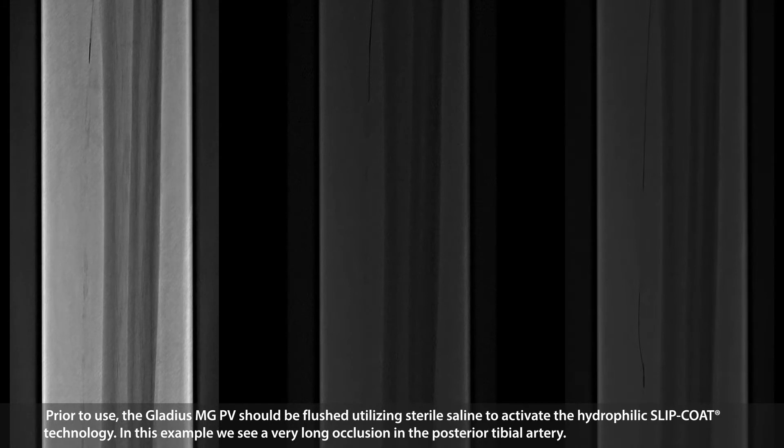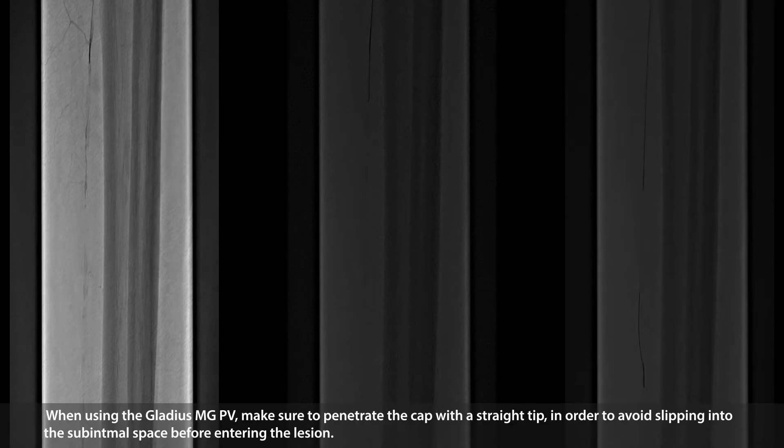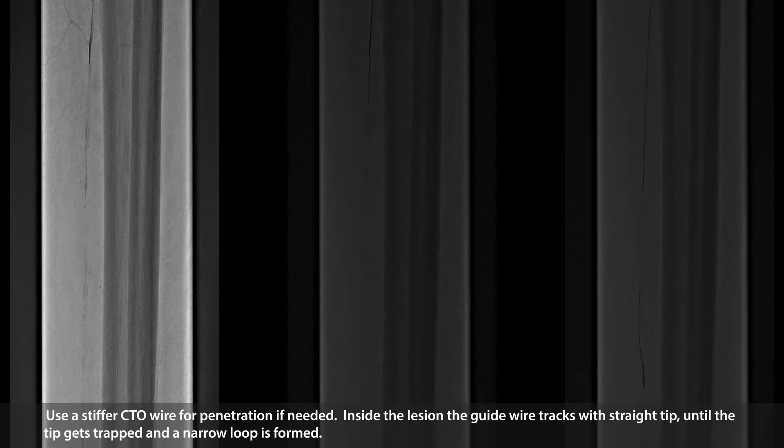In this example, we see a very long occlusion in the posterior tibial artery. When using the Gladius MGPV, make sure to penetrate the cap with a straight tip in order to avoid slipping into a sub-intimal space before entering the lesion. Use a stiffer CTO wire for penetration if needed.